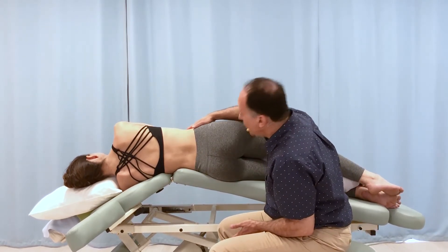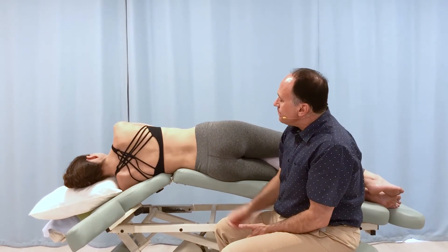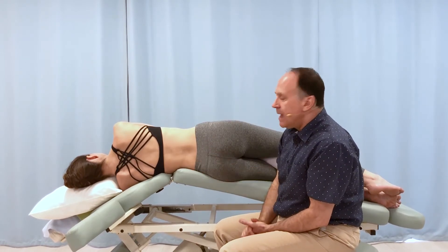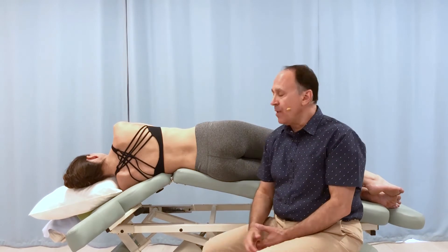Checking in — she confirms she's comfortable. So we can do this this way, but we can also mix this with using a bolster.